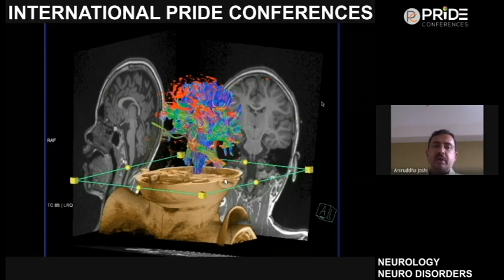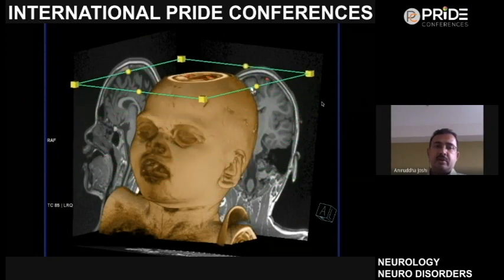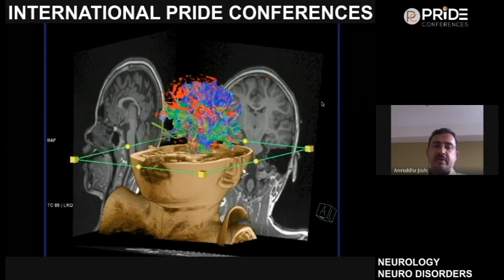We do tractography in each and every patient whenever a surgical patient is undergoing any surgery.